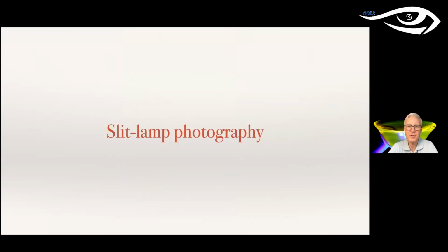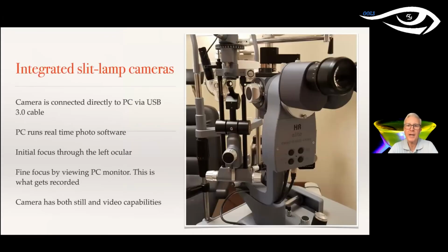All right, so slit lamp photography. Let's talk about that for a minute. After several years of taking photographs with my iPhone, I realized that this is something I wanted to do with virtually all my patients. And so I invested in a photo slit lamp. So if you're in the market for a slit lamp, you might consider spending a little bit more money and actually get something with an onboard camera on it. In my case, the camera's connected directly to the computer via a USB cable.